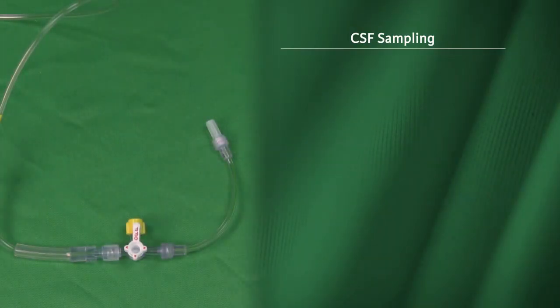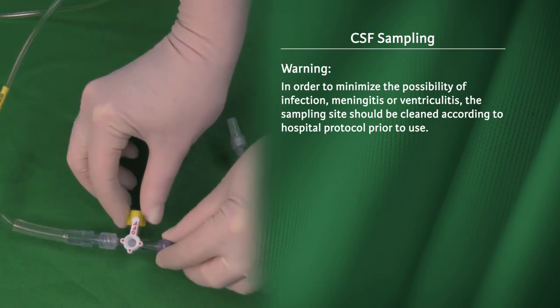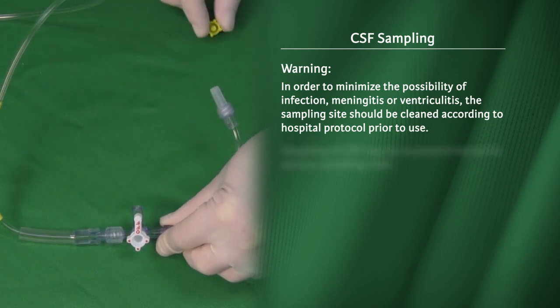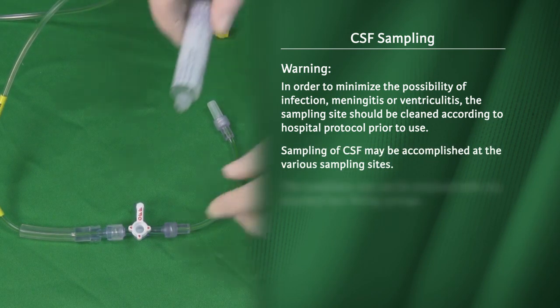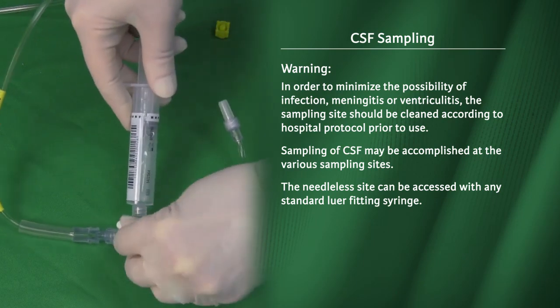CSF sampling. In order to minimize the possibility of infection, meningitis, or ventriculitis, the sampling site should be cleaned according to hospital protocol prior to use. Sampling of CSF may be accomplished at the various sampling sites. The needleless site can be accessed with any standard luer-fitting syringe.